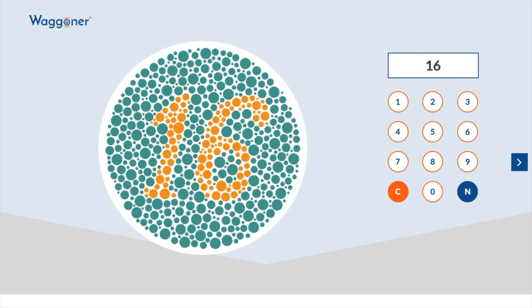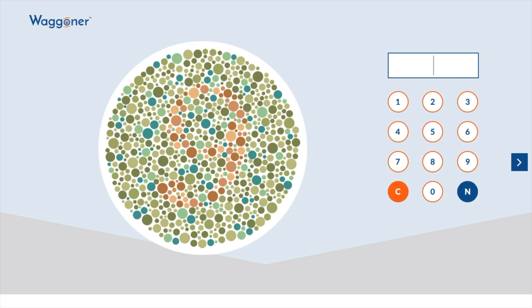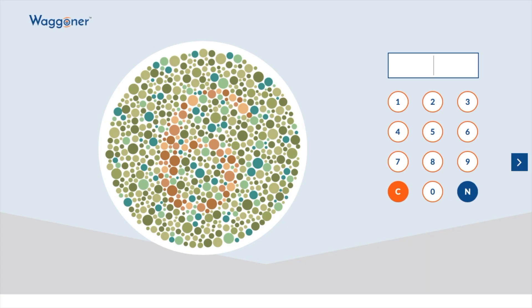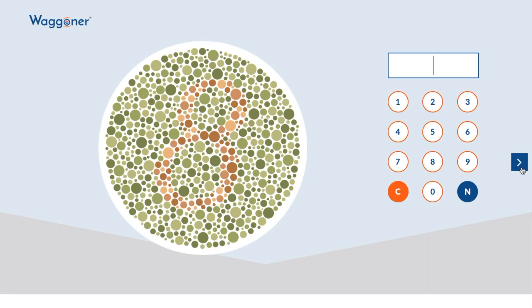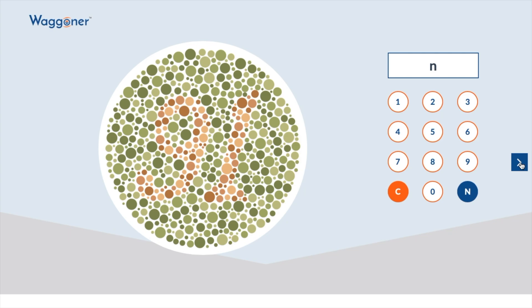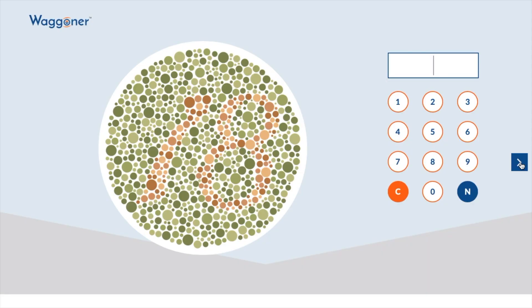This is the testing page. There are two ways to enter answers. One, you can simply use your mouse or touch screen and enter the answer from the keypad and then select the arrow. Or two, you can enter the answer using your keyboard and then select enter. Each process will take you throughout the test smoothly.